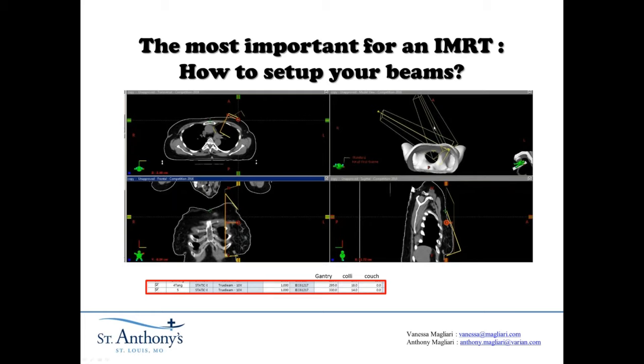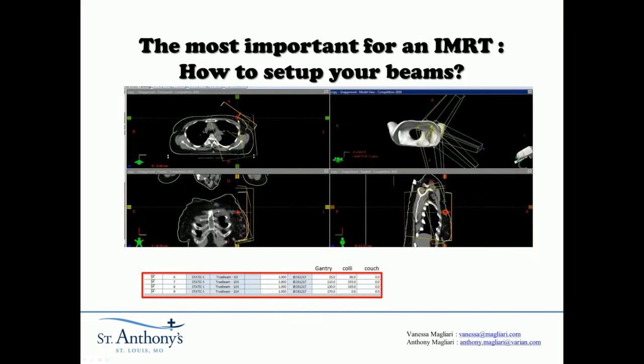Let's go over the rest of these beams. This one actually looks pretty on BEV — maybe couch at zero. We used this on-BEV beam here, and this was our only 6X beam, which helped fill in all of the dose not quite all the way to the surface, since we used 10X for all the other beams. Some beams were fixed to only treat a specific part — this particular PA beam is not actually going to treat all the way across.